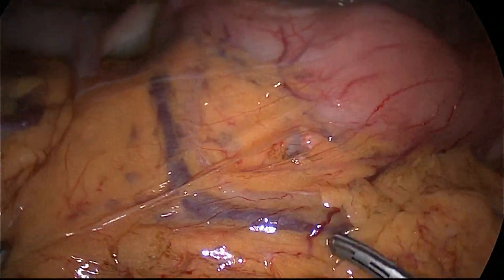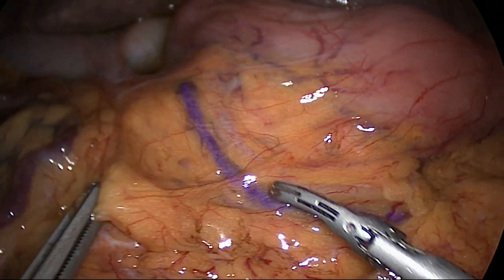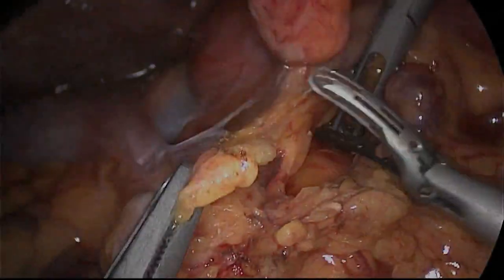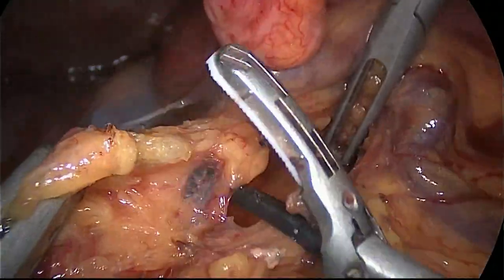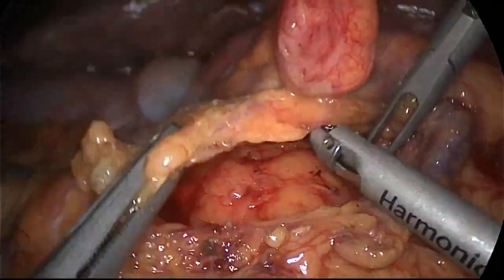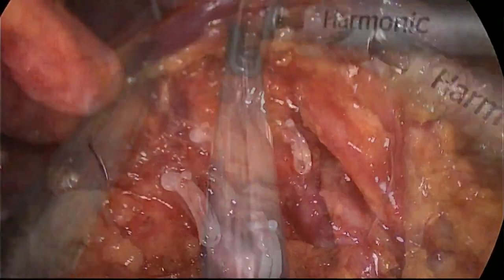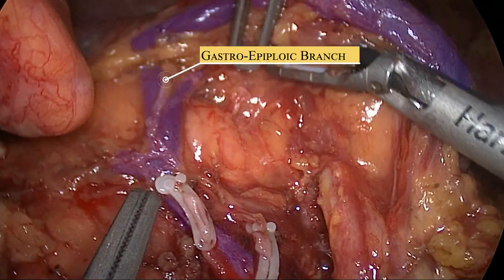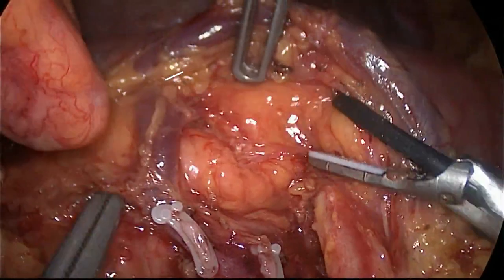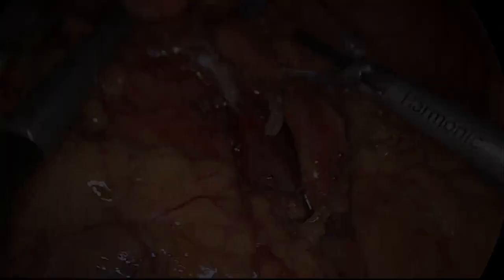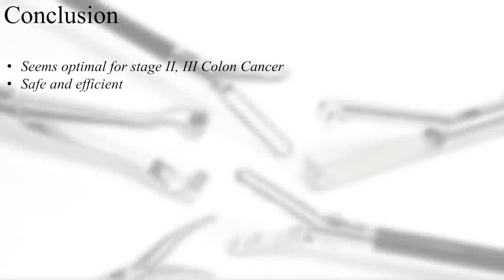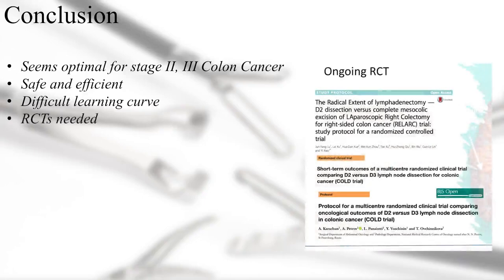Finally, we identify the gastroepiploic vein when entering the lesser sac from above after opening the colic omental attachments. As a conclusion, complete mesocolic excision seems to be adequate for stage 2 and 3 colon cancer. The latest literature shows equal peri- and post-operative complication rates as the technique becomes more widespread. It still presents a difficult learning curve, and we await the results of ongoing randomized controlled trials that might make it the gold standard in right oncologic colectomies.